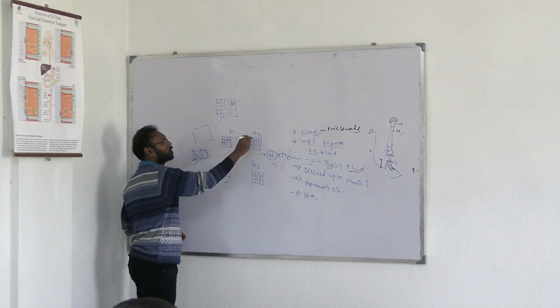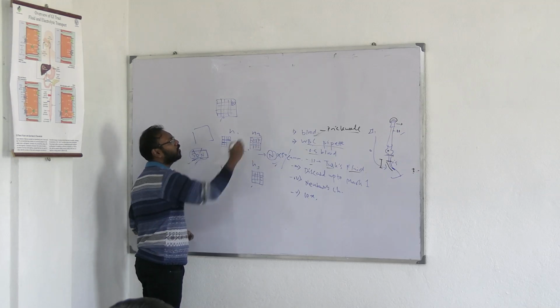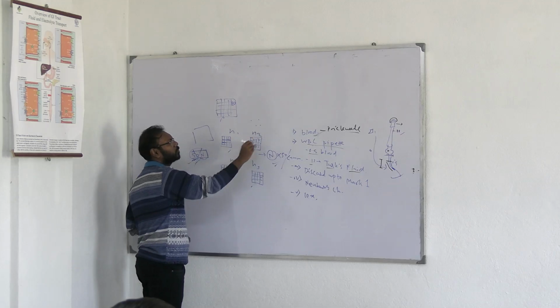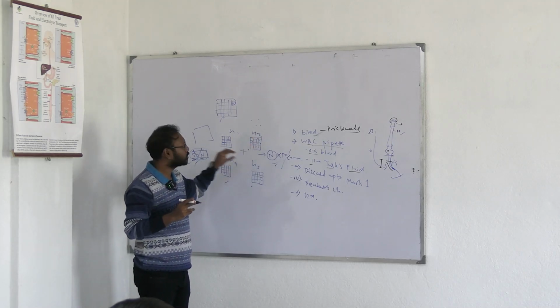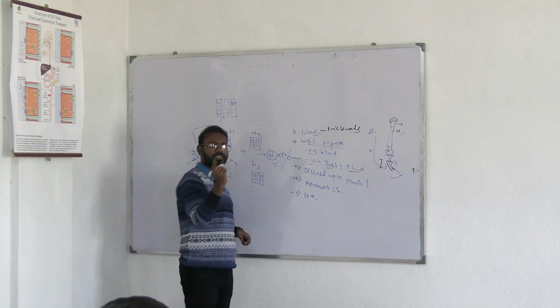The cells we will be seeing are small, like needle dots, dots made by a pen. You are able to see them because they are colored. This colored structure comes from the Gentian Violet.